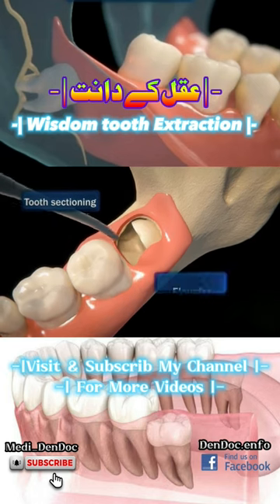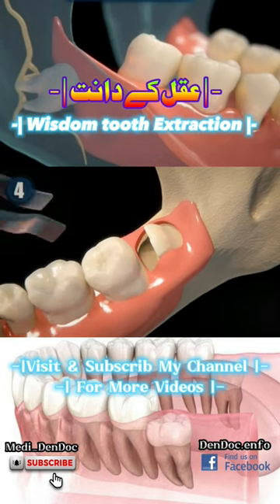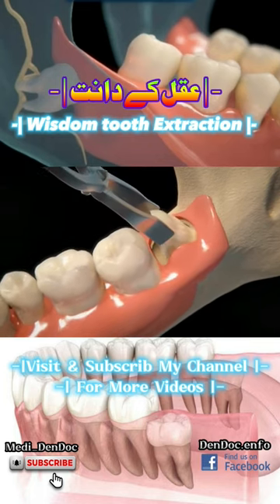Once the tooth is divided, the dentist will use an instrument called an elevator to push the tooth out, and then with the help of metal tweezers, the expert will proceed to pull it until it is completely out.